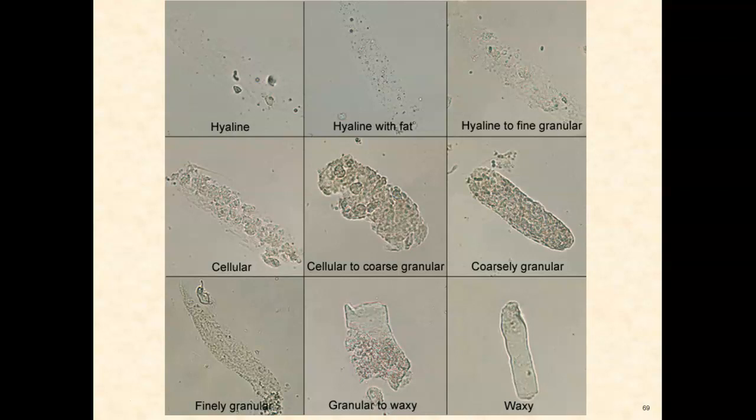What's causing this shape is that Tamm-Horsfall protein. As other things are happening up in the kidney, we can start to see cells and things get stuck within that cellular matrix, and then we can give it a title. For example, there's white blood cell casts, red blood cell casts, and we can tell what they are just by looking at them. So we're going to run through each of these individually.